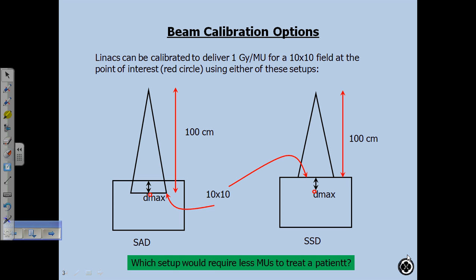Okay. So that's called an SAD setup. Yeah. Okay, because your point of interest is at the isocenter. But you guys need to know that some centers also calibrate an SSD setup. So this is what this slide talks about.